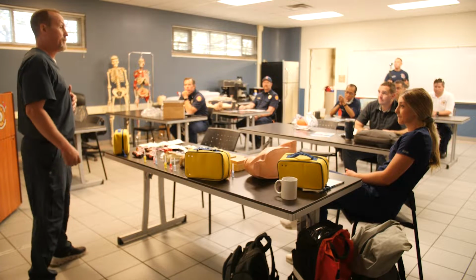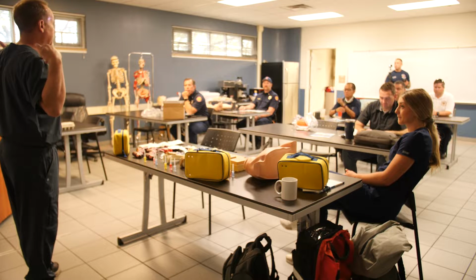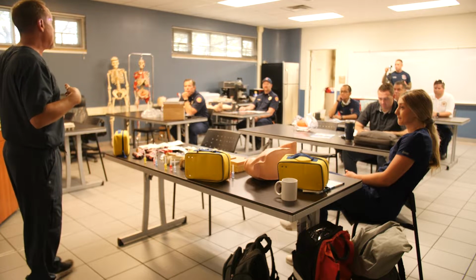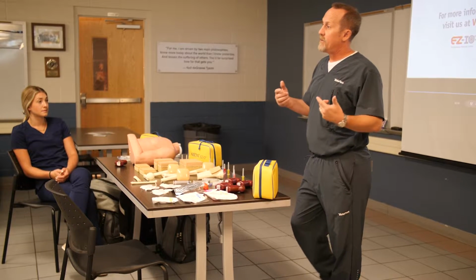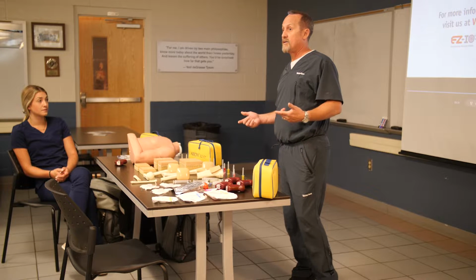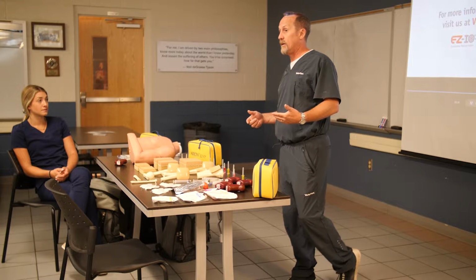The second reason why this is such a good area for you guys to go into is because of proximity to the heart. We can actually put fluids in here, not only going to get that huge high flow rate, but it takes about 3 seconds to process. If they put a central line in the ED, they typically are taking that out within 24 hours because it's considered a dirty line. They don't want to leave that in there.